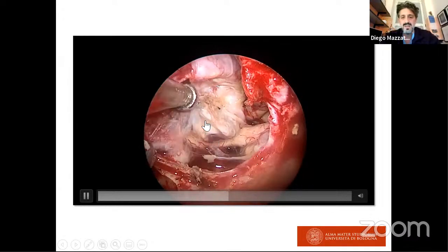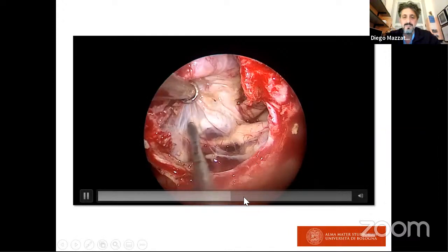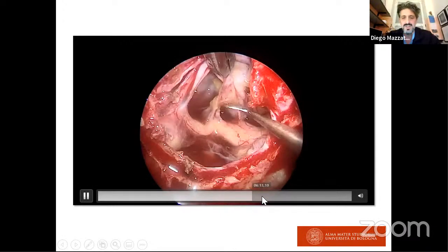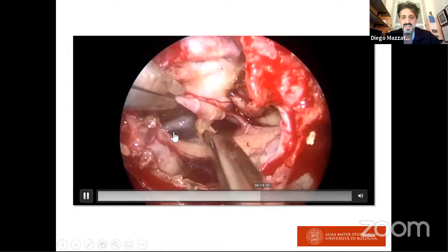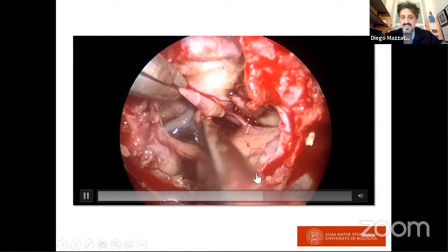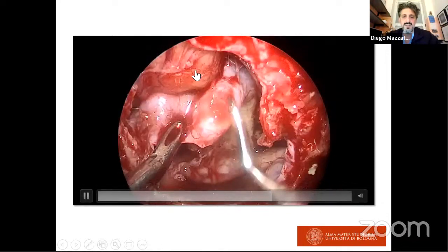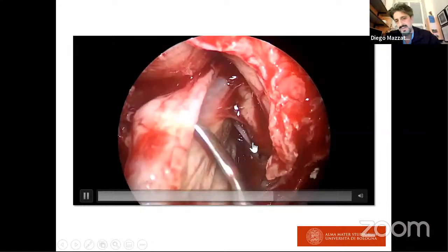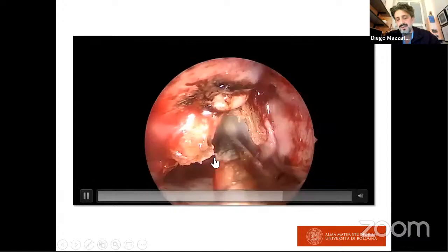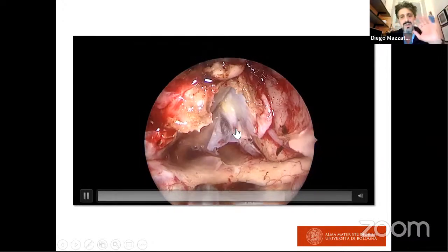Posteriorly, there is the A1, A2 complex. This is the gyrus rectus. We try to dissect the tumor capsule, managing the optic pathway. Posteriorly, A1, A2 on the right side. Obviously, this is the dissection of the capsule from the gyrus rectus, and also managing the frontopolar arteries. When we arrived in front of the A1, A2 complex, it was impossible to dissect, and we stopped the tumor removal.